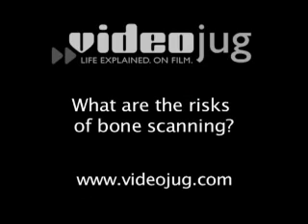What are the risks of bone scanning? The risks of bone scanning are basically related to the radioactivity that is administered, which is extremely small and very similar to the other tracers that are used in general nuclear medicine. With frequent voiding and good hydration, the radiation dose to the urinary bladder, which is the major organ which receives the most of the absorbed dose in this case, is diminished tremendously.